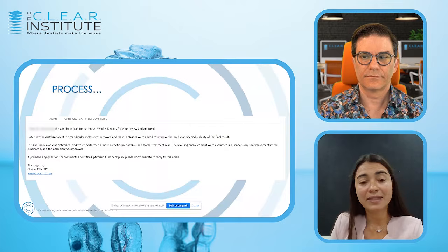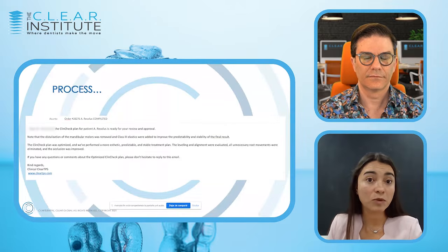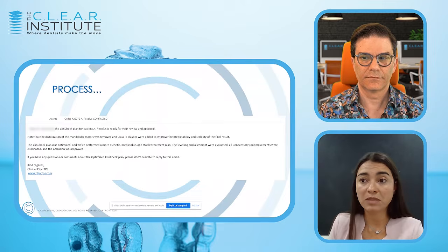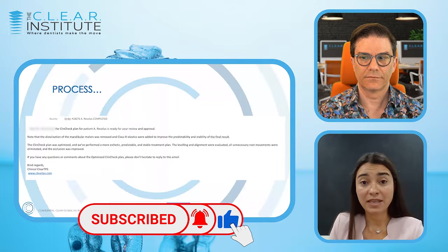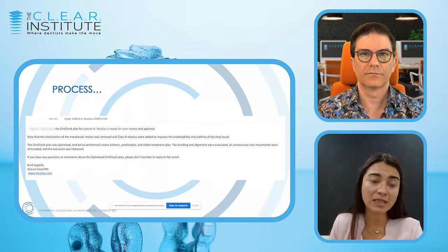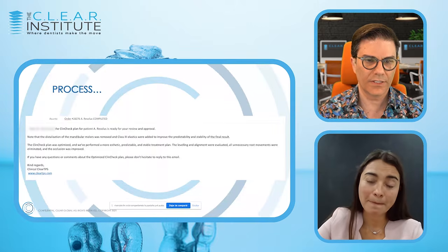What we see is that the majority of the time we provide a final ClinCheck that doctors are ready to be approved. But for some instances, very few times, doctors can do another modification or ask us for questions. And the idea is that we have saved the doctor a lot of time by doing most of the process. And if need be that the doctor needs to do any additional changes, it's just minor. That's it. That's one of the first things.